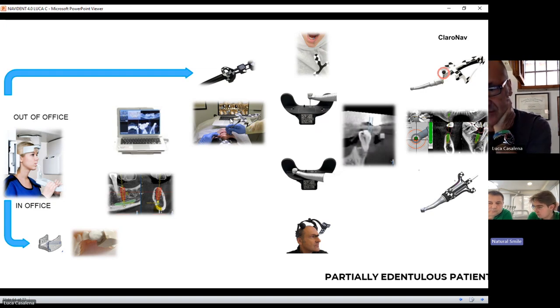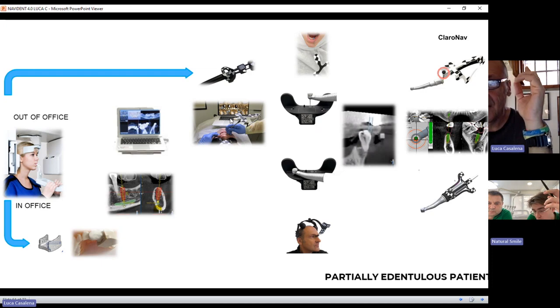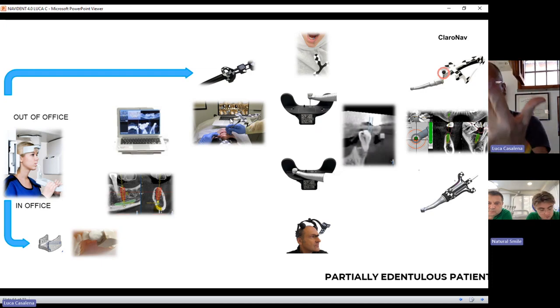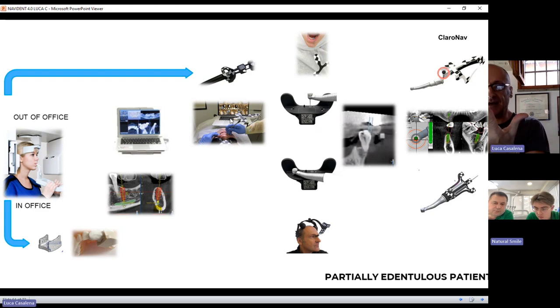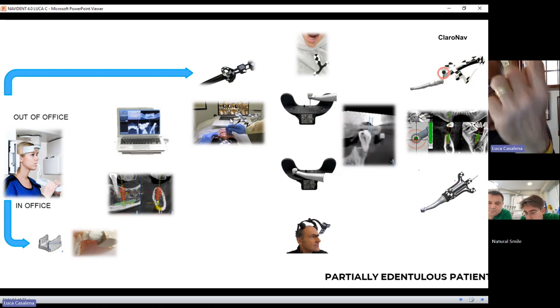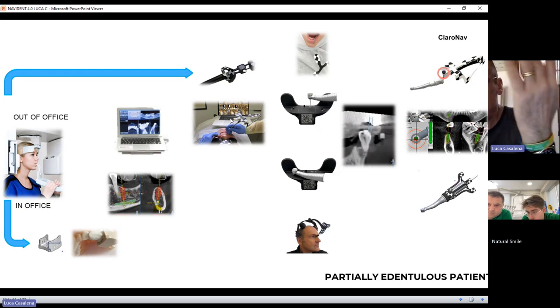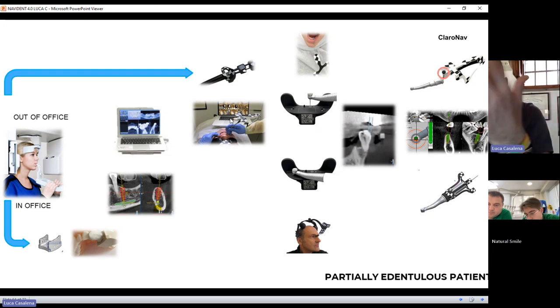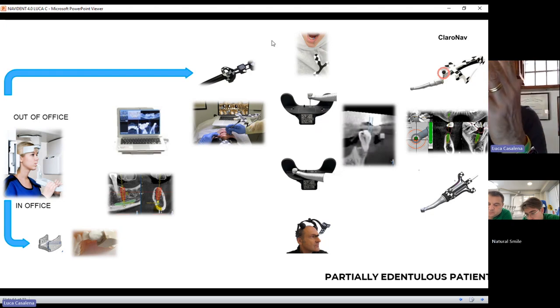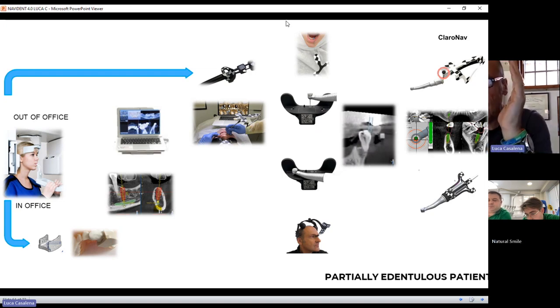By tripod, I mean two molars and an incisor — look at the hand: two molars at the back and an incisor above. Or you go for two premolars and an incisor. If you don't have premolars or an incisor, go with whatever is available — maybe two canines and then an incisor. Depending on what's available in the patient's mouth, you pick up a tripod. When scanning with the tracer, you always start from right to left, never left to right — the first trigger point is the first one on the right.